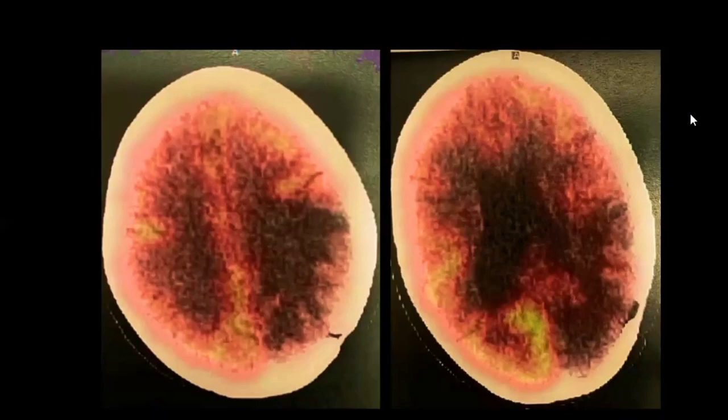On PET scan, axial section, I can see there is no uptake in the region of the site of the surgery or in the site of the previous metastatic deposit. That confirms my diagnosis of radiation necrosis. It's not a recurrence, and it's not a secondary deposit.